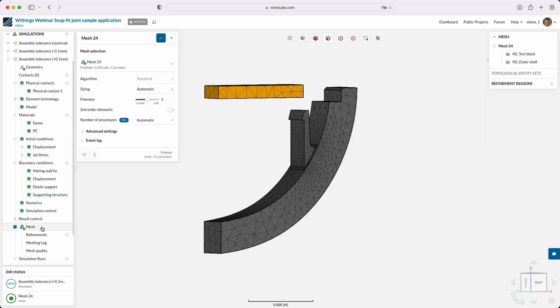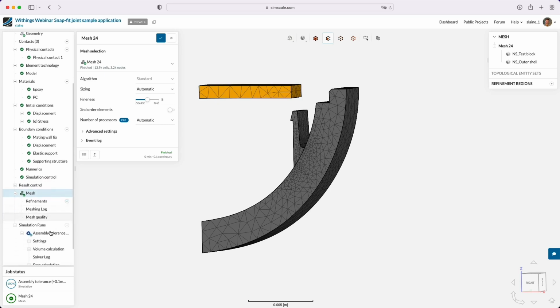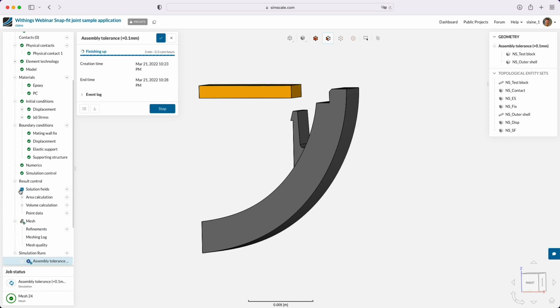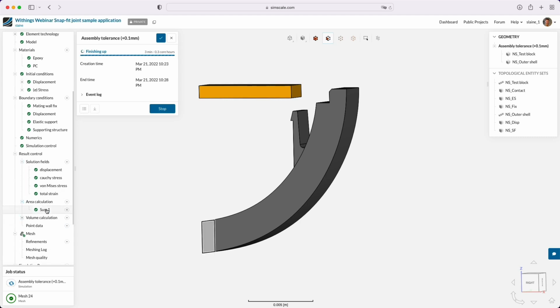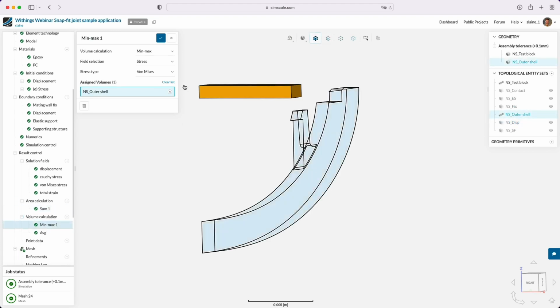For the mesh that we're using here, we've actually stuck with the original standard mesh settings. It's a physics-based mesh, so we don't need to worry too much about this. The standard settings give us a nice balance between simulation time and accuracy. So we can see on this base plate we've only got minimal refinement at this end, but where we've got the contact it's slightly more refined. Okay, and coming down now we'll have a look at the simulation. That's nearly complete. So the other thing that we've done here is we've added the result control. So this allows us to get some analysis out, such as the area calculation for the sum of the reaction force, the volume calculation for min and max stress, and the average stress in that component.